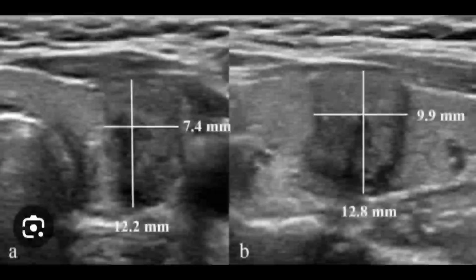This is another nodule where you can see the AP is 12.8 and the mediolateral length is 9.9. It means this nodule is taller than wider. So this is another criterion. Always consider certain points, like whether it is solid or hypoechoic, and whether it has a lobulated or irregular margin.